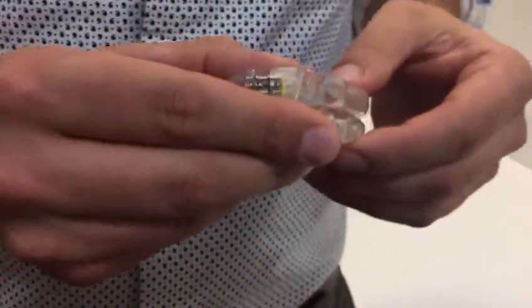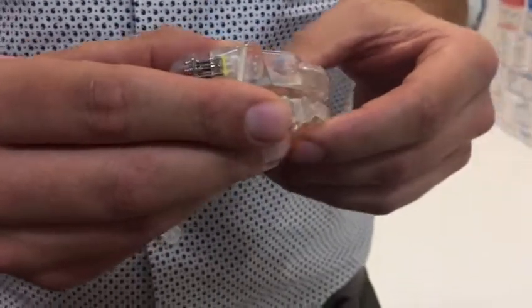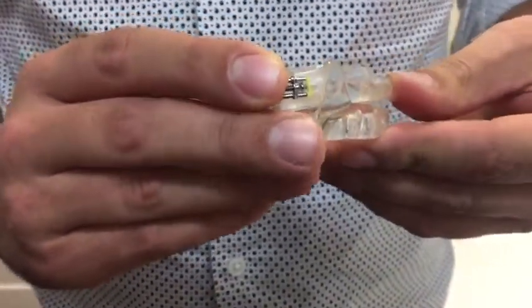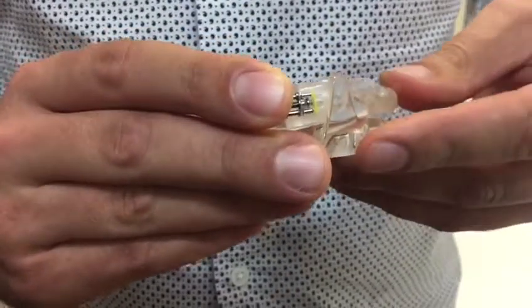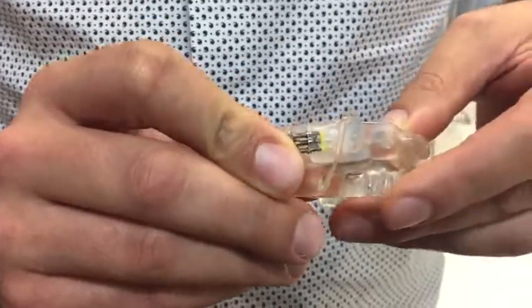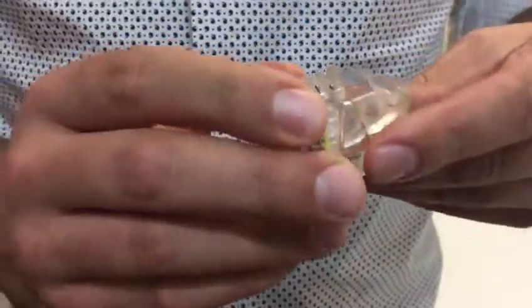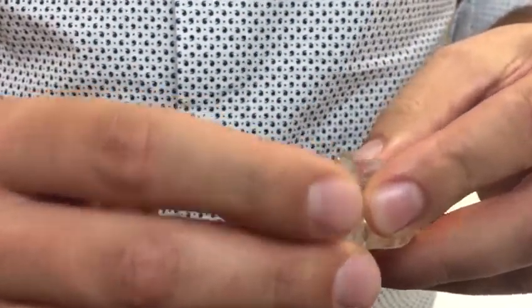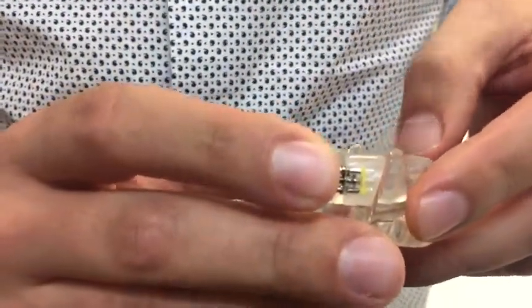Traditionally it's been made with an acrylic resin like this, and while this has been very successful in its functioning and helping with stopping snoring and limiting apnea, it's also had to be made of a slightly thicker material because it's more brittle and more prone to fracture. This means that it's bulkier in the mouth — for some people, prohibitively so.